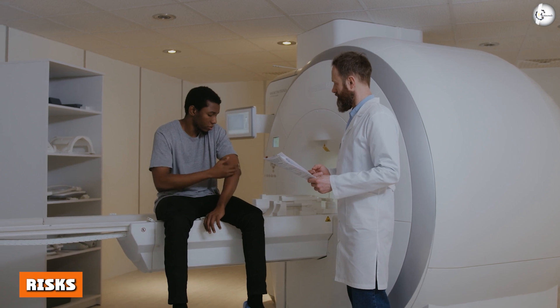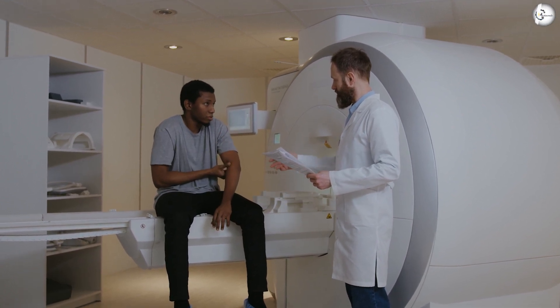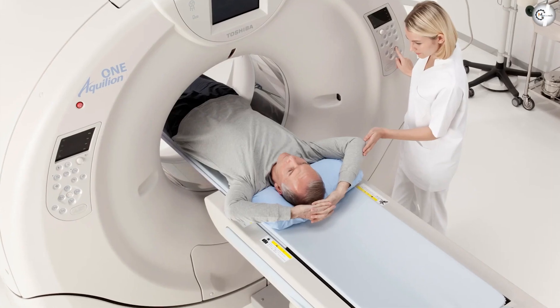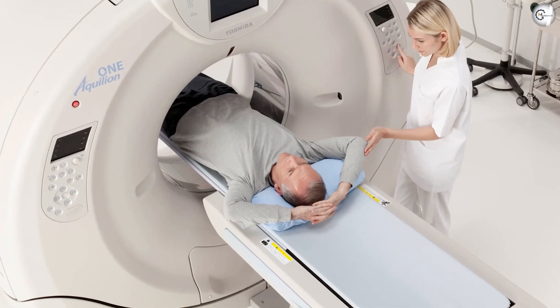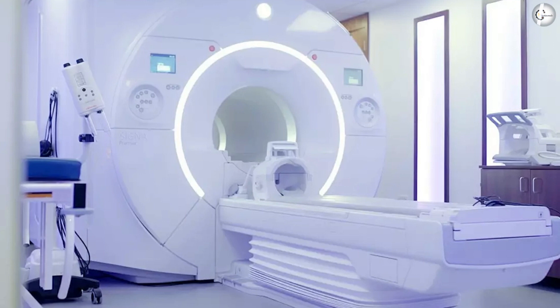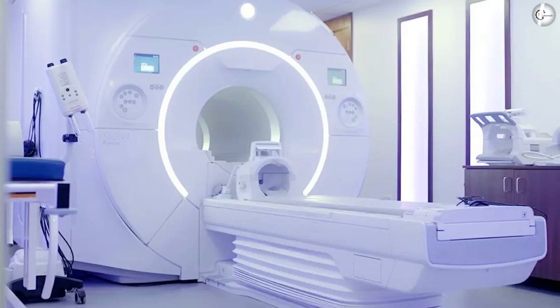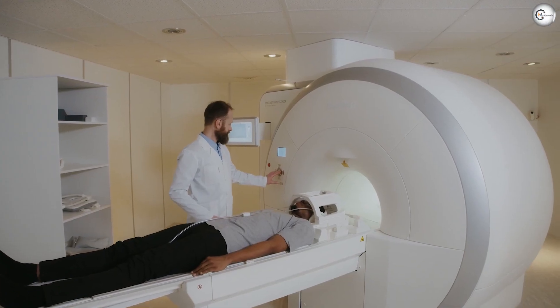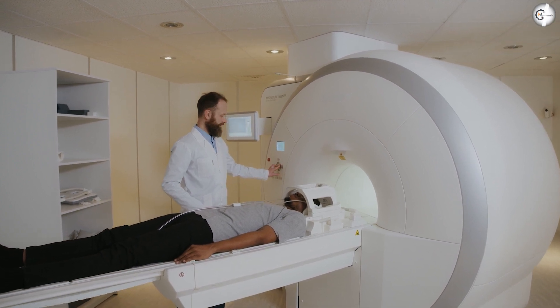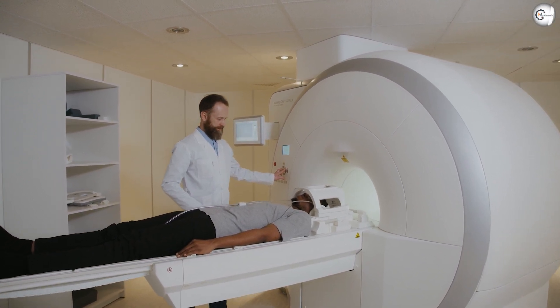Other differences between MRI and CT scans include their risks and benefits. CT scan risks include harm to unborn babies, a very small dose of radiation, and a potential reaction to the use of dyes. MRI risks include possible reactions to metals due to the magnet, loud noises from the machine causing hearing issues, and increased body temperature during long MRI sessions.